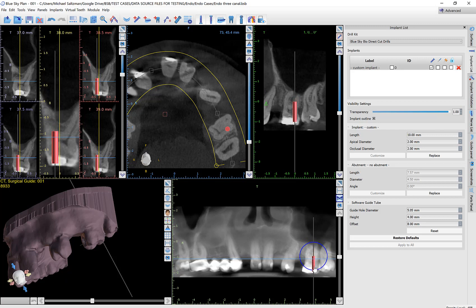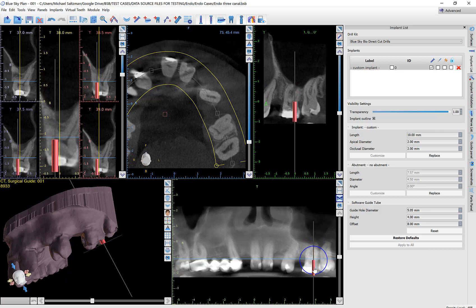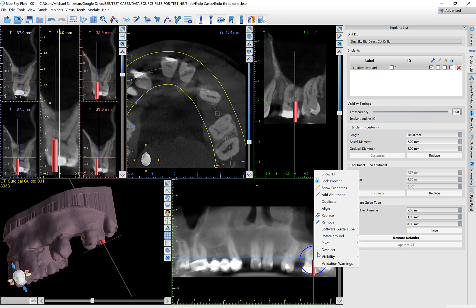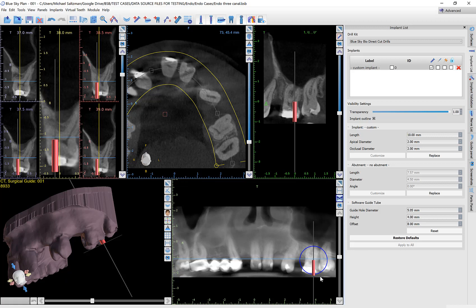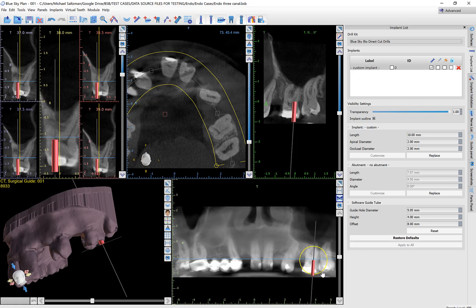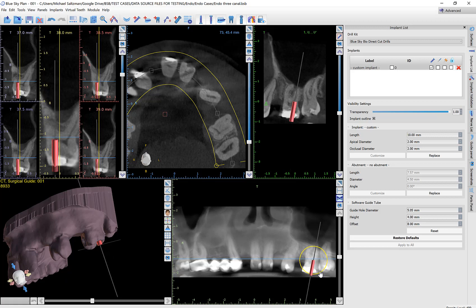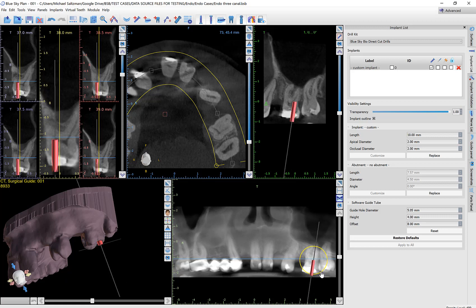Now I'll use my various views to grab and drag that implant. I'm also going to right-click, now that I have the implant placed, and choose 'Pivot around the implant tip.' Usually when you rotate the implant the whole implant rotates, but here we are rotating it based on the tip — the tip stays in the location we placed it and the implant rotates based on the tip. This allows us to set our drill path based on that implant.